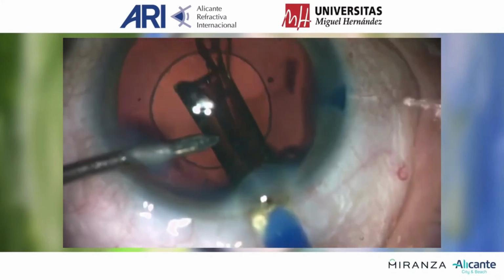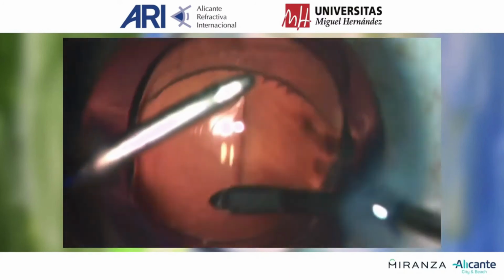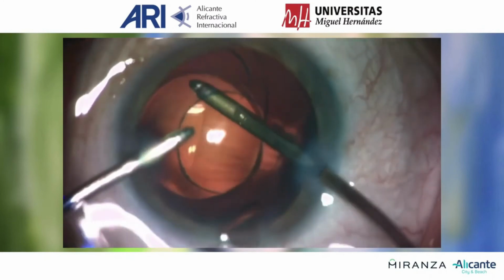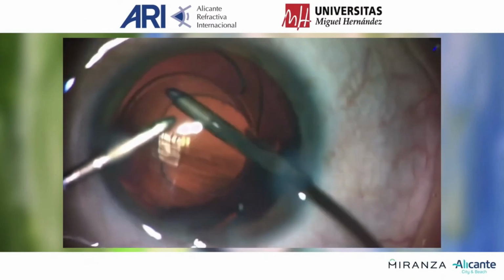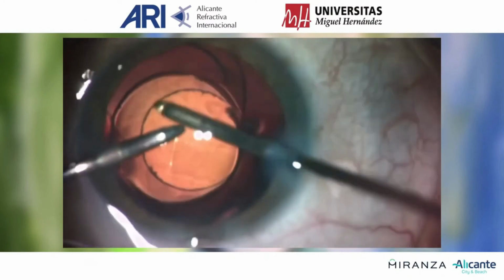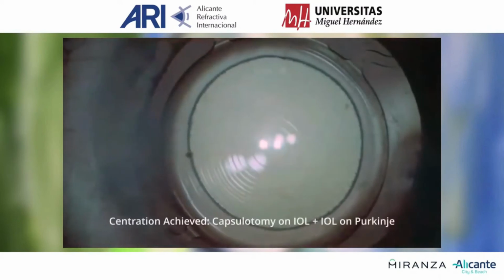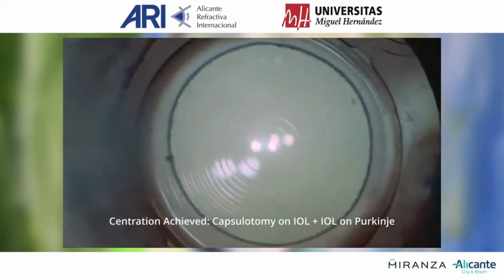The trifocal intraocular lens is being injected, and OVD irrigated from behind its optic. The capsulotomy is perfectly centered over the trifocal lens optic at the conclusion of surgery.